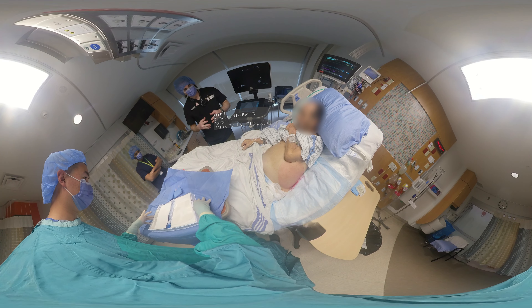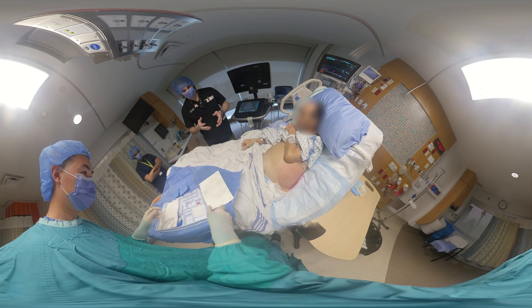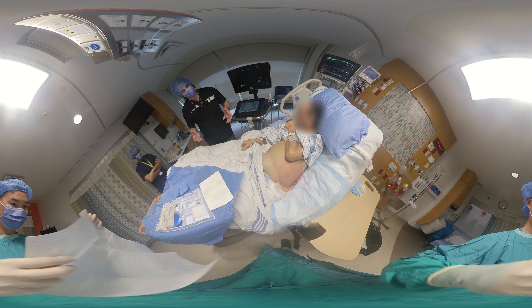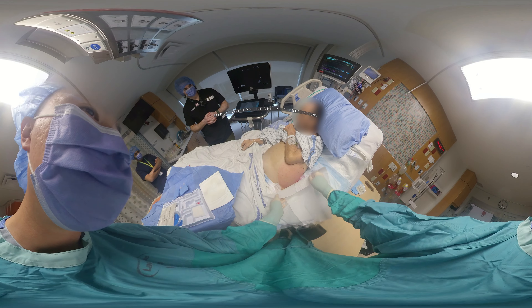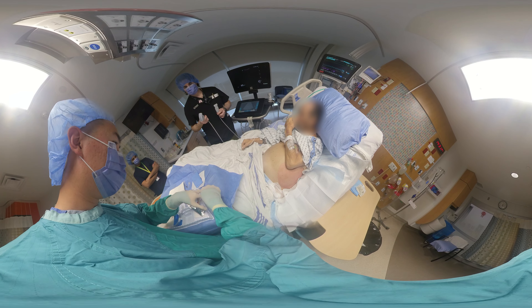First, you've prepped the area and made sure you've landmarked the proper anatomical area. You will now drape the area to expose the area of puncture. We're going to choose the left lower quadrant for convenience, as there are studies showing that this side of the abdominal wall is thinner.